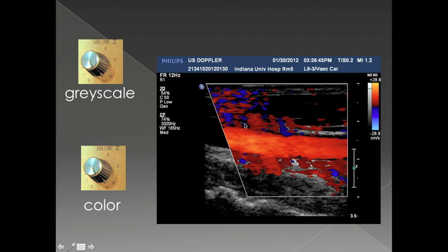For color Doppler, if the gain is set too high you'll see artifacts outside of blood vessels and too much color. If the color gain is set too low, you won't be able to detect flow even within a large blood vessel such as the carotid.